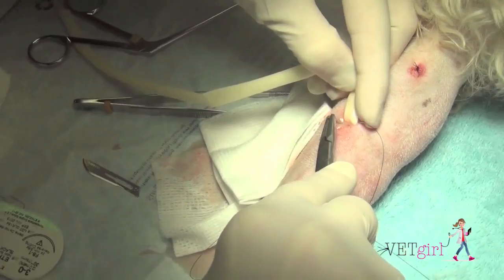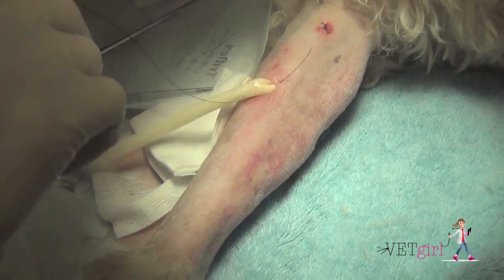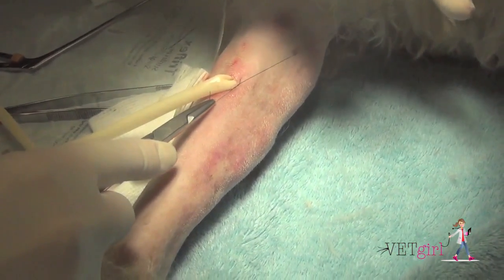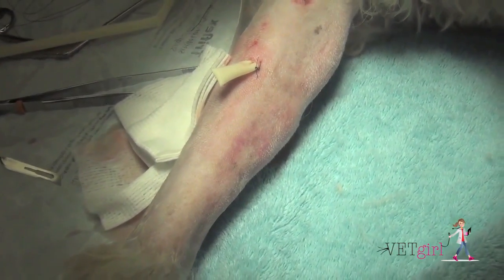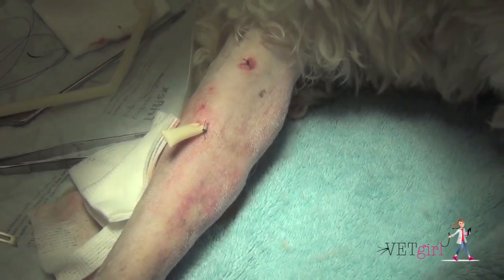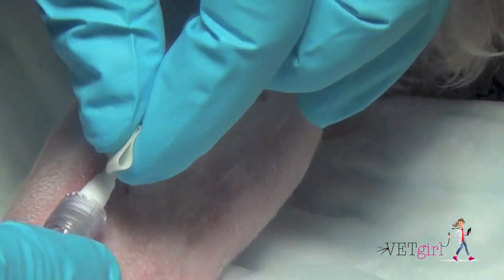Then we're going to leave one simple interrupted suture with relatively long tags so we can remove this in two to three days. We're also going to secure the ventral or distal part of the drain and make sure that's sutured in, again with one simple interrupted suture, which we'll remove in two to three days.